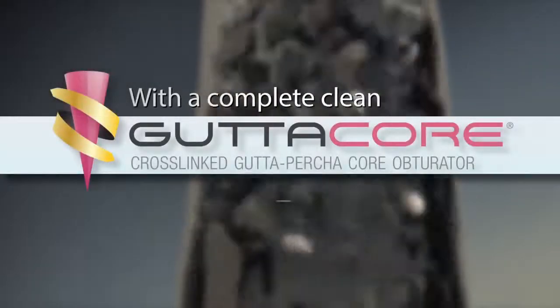With a complete clean, GuttaCore is free to flow into dentinal tubules, isthmuses, and lateral canals.